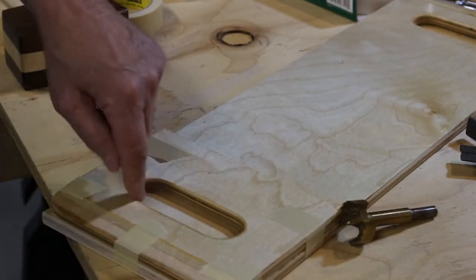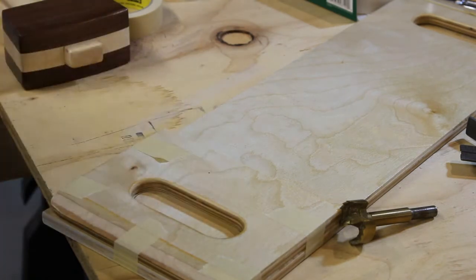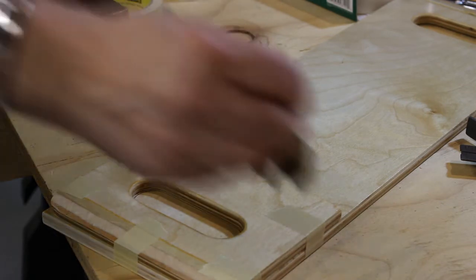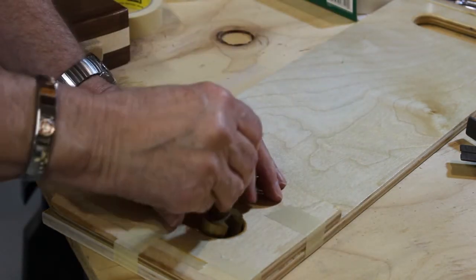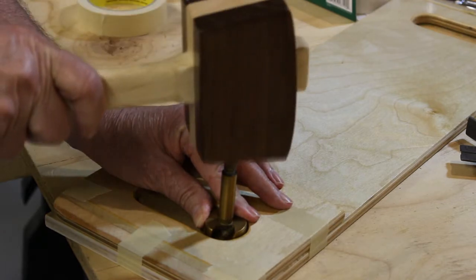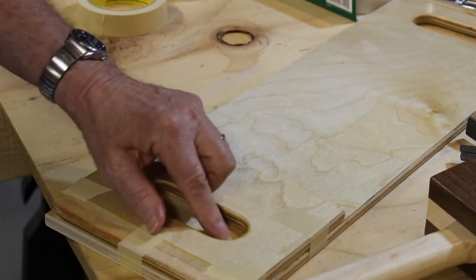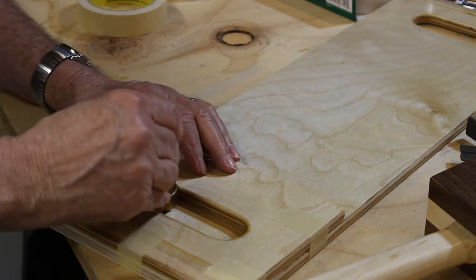I've determined that this opening is an inch and three-eighths across, so I've got an inch and three-eighths Forstner bit. I'm going to get it in the corner as tight as I can and then give it a tap with my mallet. That'll give me a spot to start on the drill press. I'll do the same thing at the other end.